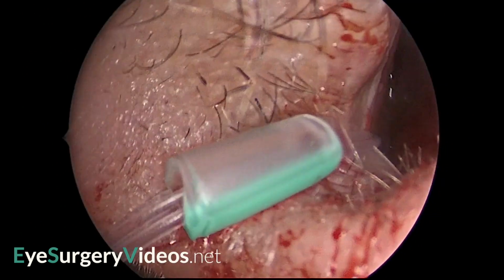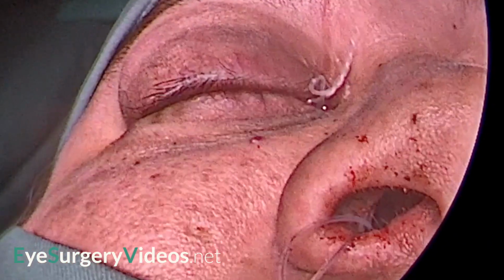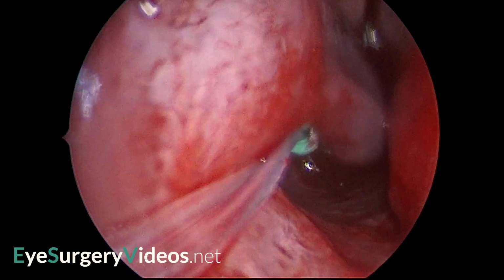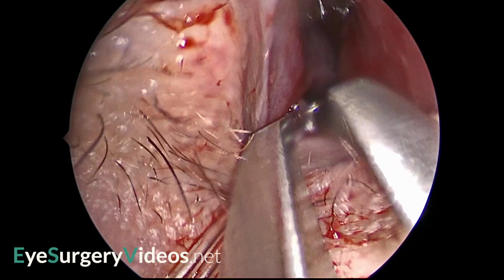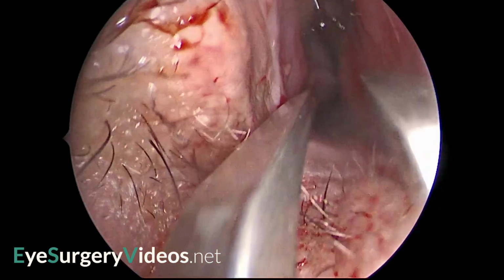Both ends of the stent are passed through a small section of size 8 feeding tube, which is advanced superiorly. Simultaneously, a ball probe or similar instrument is being held under the loop of the stent at the medial canthus to ensure that the securing feeding tube is not advanced too far, which would risk cheese wiring at the puncti. Liger clips are placed inferior to the feeding tube to secure its position. Alternatively, the stent can be secured with a knot.